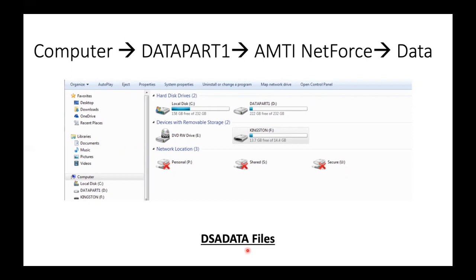And from there, this is very important. What you're going to want to do is transfer that file, as the text file that it's going to be saved as, onto a flash drive, because the MyoForce software is not located on the AMTI NetForce computer. So you want to save that to a flash drive that you can plug into another computer that has the NorAxon software on it. And that's where this next piece of the lecture is going to continue on off of.